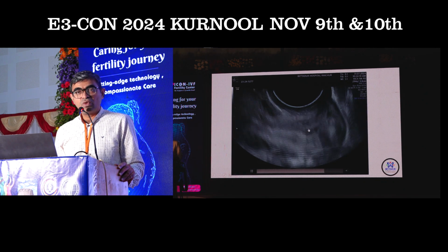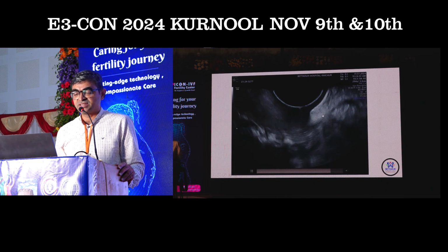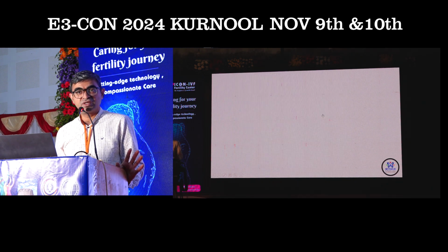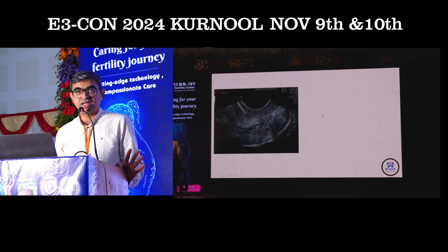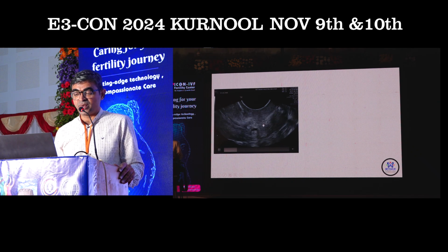So we'll move to the common and basic pathologies that we see. Benign conditions are very common, and you almost always see them in all the uteruses you span across: the Nabothian cysts or Nabothian glands, which are usually on either side of the endocervical part.